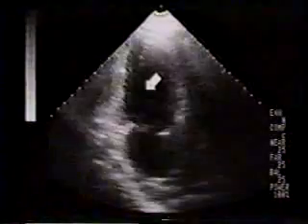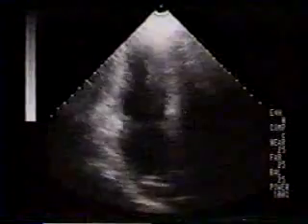The ruptured papillary muscle is also nicely seen in this apical two-chamber view. In real time, the inferior infarct is also evident. Following the echo, an intra-aortic balloon pump was inserted, and this patient underwent successful mitral valve replacement.